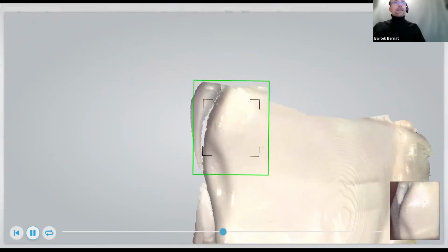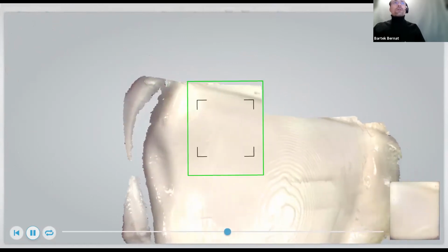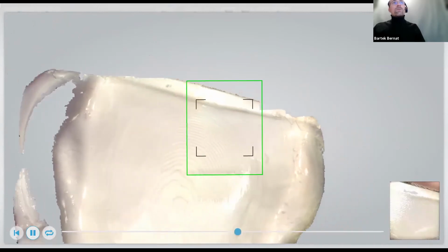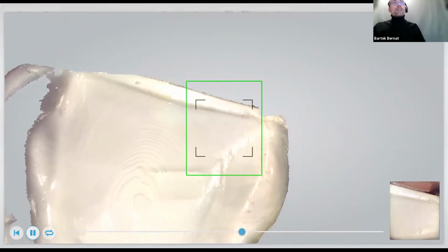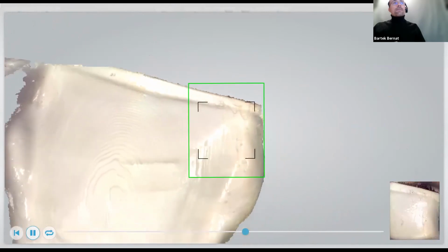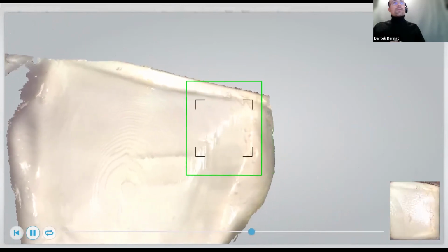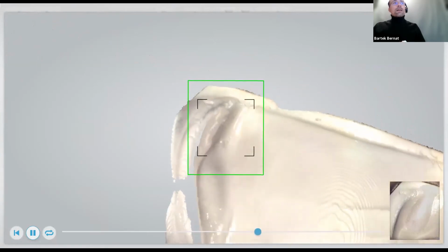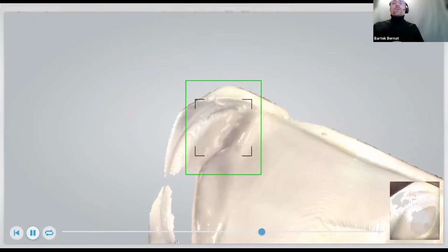So if this is done, then you proceed to the buccal aspect of the ridge, obviously. So I'm finishing off the moves until the end. Yep. And once more or less here, I switch to the other side, and now continue obviously to the midline.